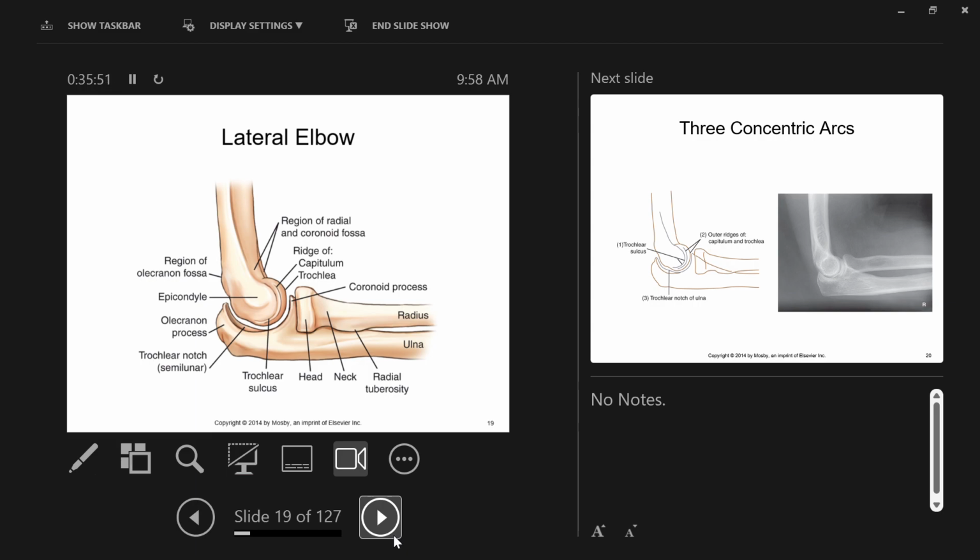And the further up I come, the worse it gets, okay? So when we do any extremity position, we want to make sure all bones associated with that anatomy to be demonstrated are parallel to the image receptor or tabletop, okay? That makes sense? Okay, good.